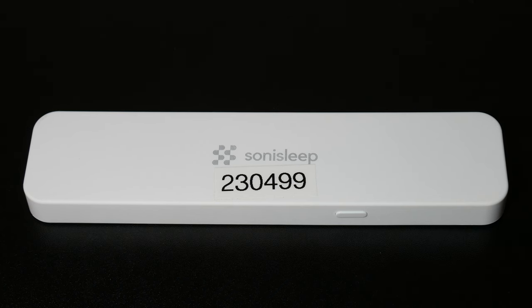The SoniSleep Sleepbar's battery will last 14 nights from one charge. This device pairs with your device via the latest Bluetooth 5.0 technology. The Sleep Bar comes in at a cost of $50.